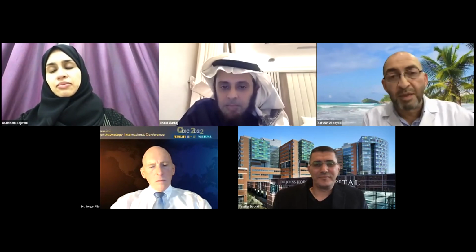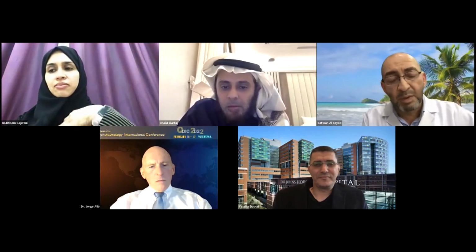Vivity is yes with a mix and match, and this mix and match gives me a better result when the patient cannot withstand minus 1.75 in one eye, so they can withstand by defocus test -1 in one eye as a residual, and the other eye will be emmetropic.